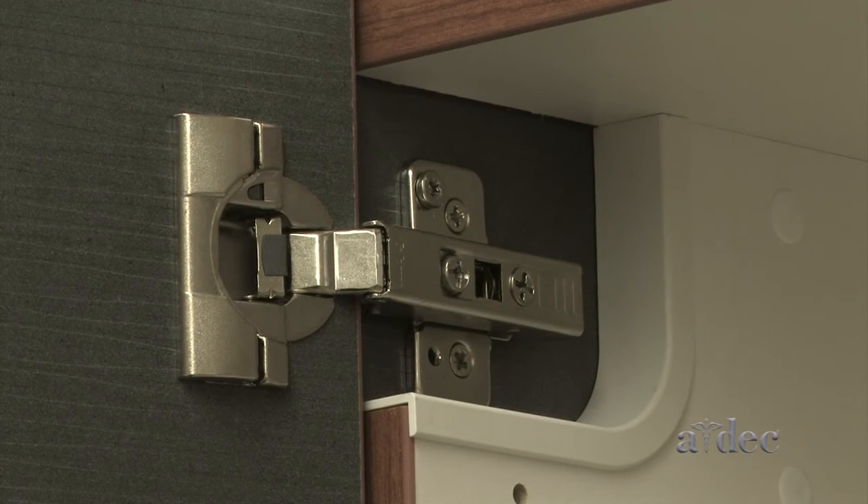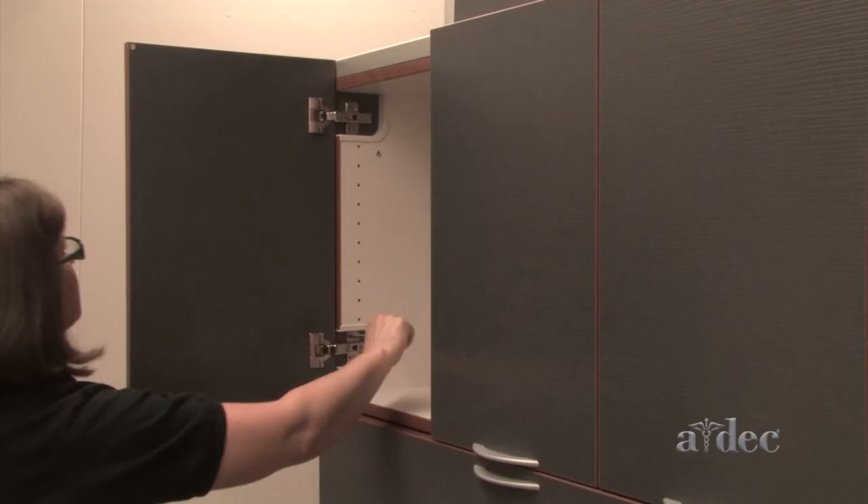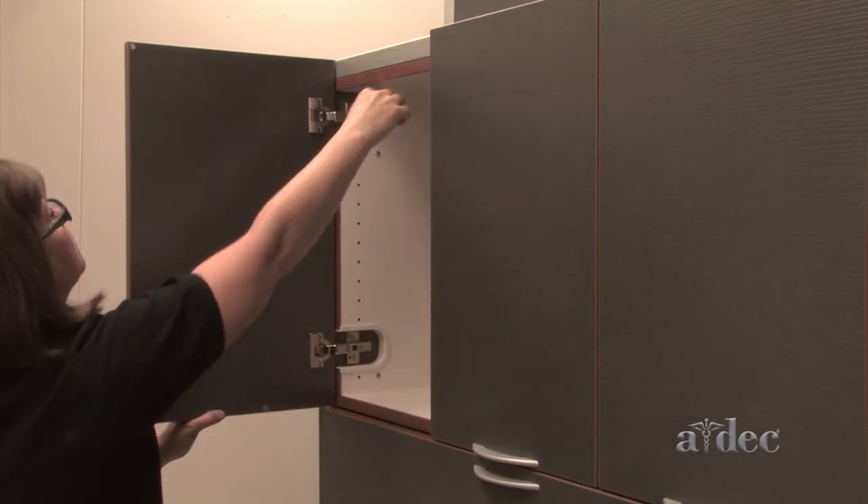For single plate door hinges, turn the cam screw to raise and lower the door and hinge.